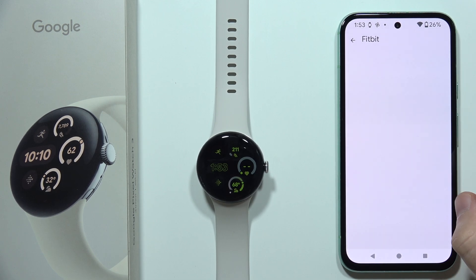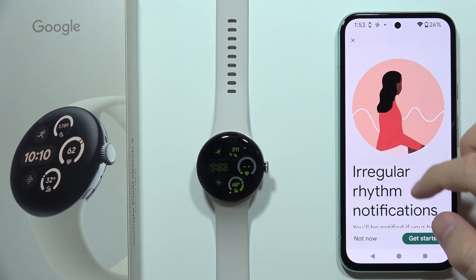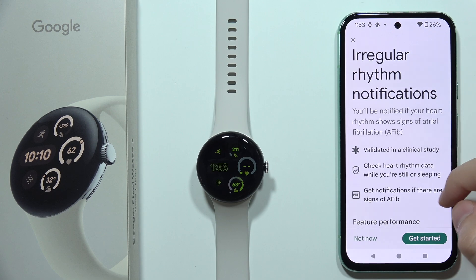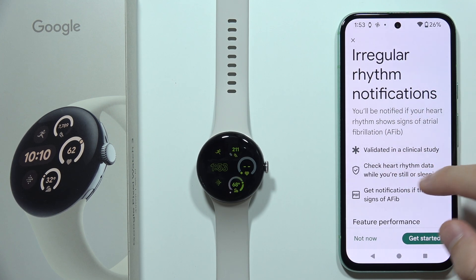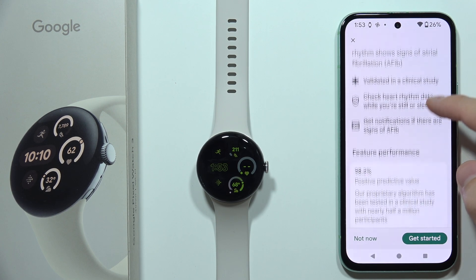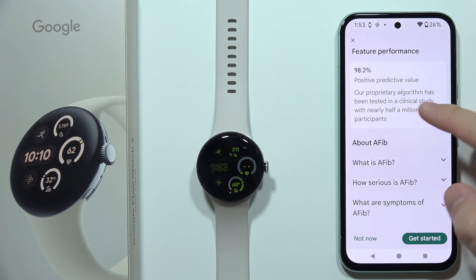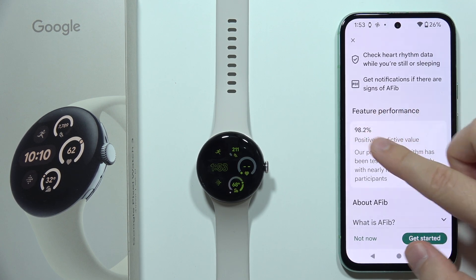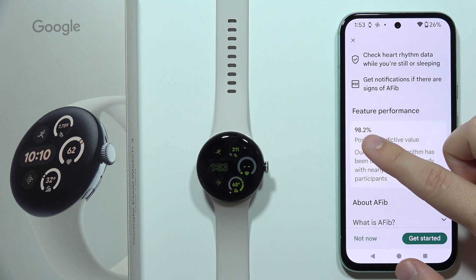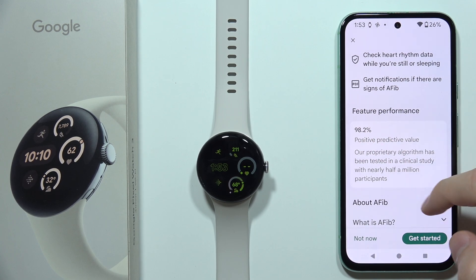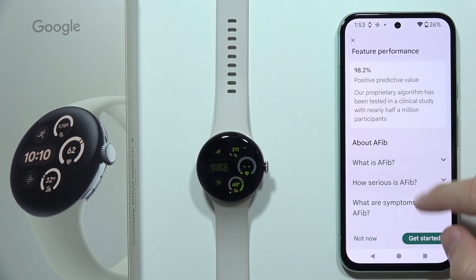Click Setup, and as you can see, you will get a notification about AFib. There is also information about the feature's performance — it has almost 99% accuracy.